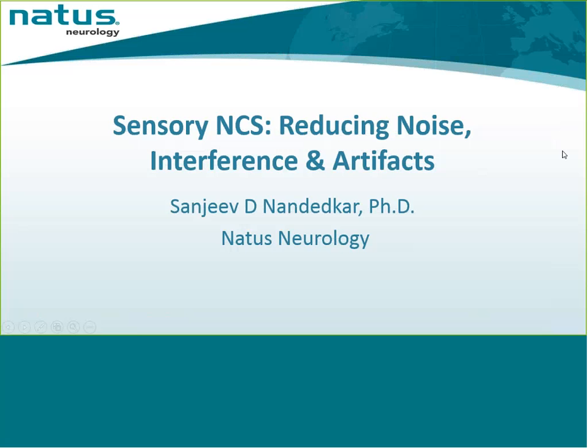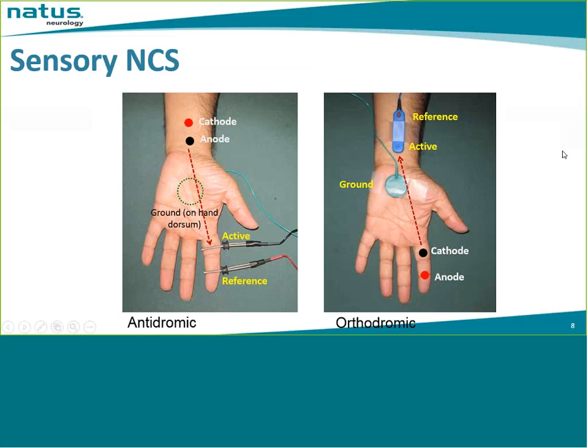Welcome to this webinar on sensory nerve conduction studies, reducing noise, interference, and artifacts. Sensory nerve conduction studies are done in two ways, antidromic or orthodromic.